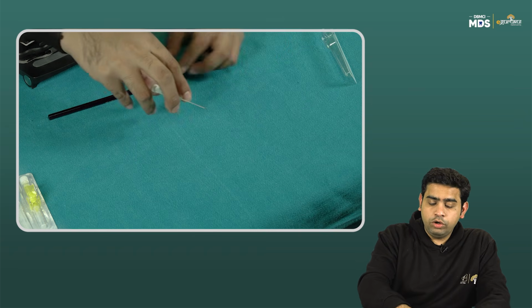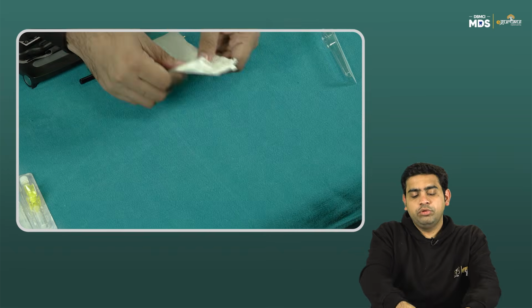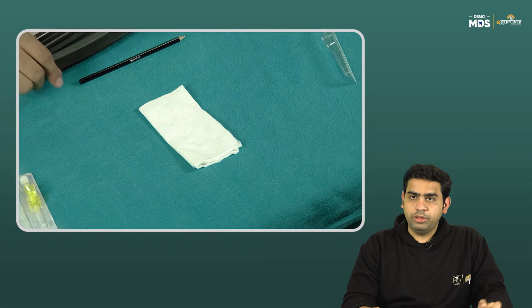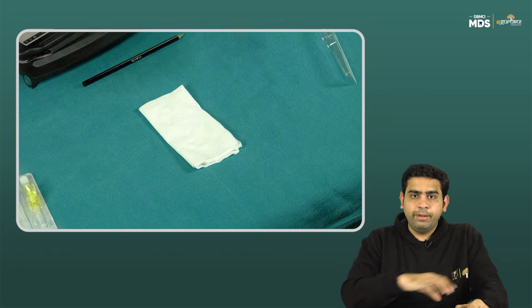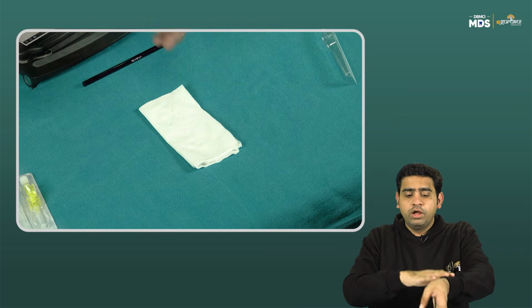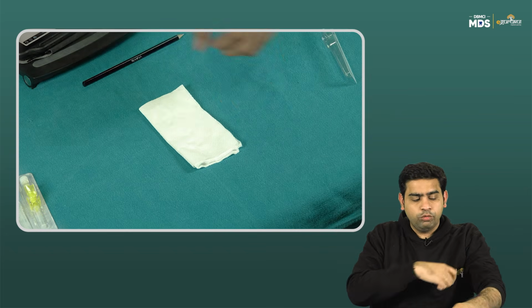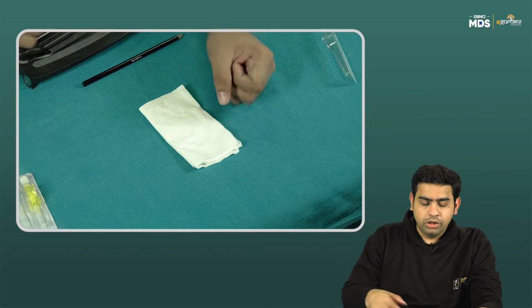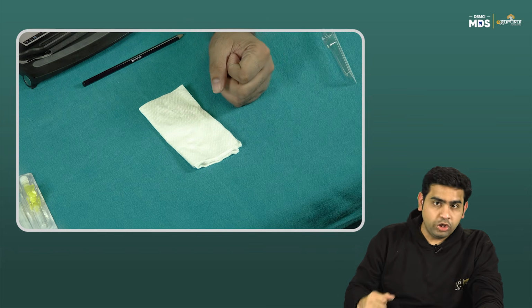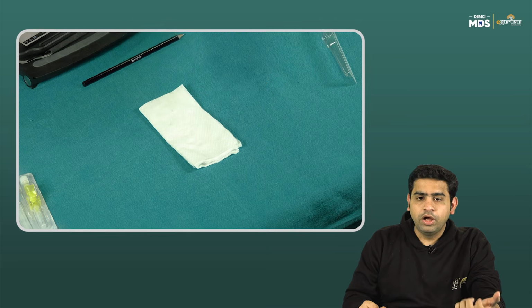Now let's assume that I want to put a cannula into this particular patient. This is the arm of the patient. So I apply the tourniquet and clean that particular part. Let's assume you want to put the cannula over here. There are a lot of hairs. If your patient has a lot of hairs, you can always trim it. Otherwise, you might find it a bit difficult to put the cannula.